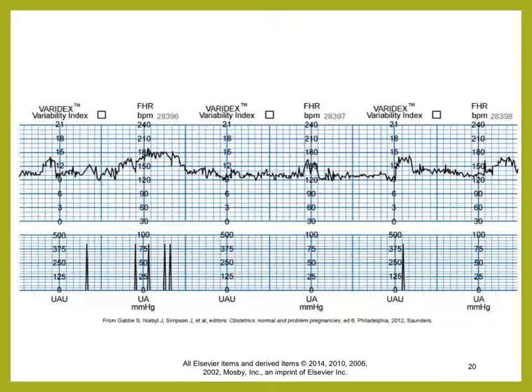There's two indicators or interpretations of this test. You have reactive versus non-reactive. This is in box 10-8, page 263. The strip you are currently looking at is a reactive non-stress test. What does that mean?